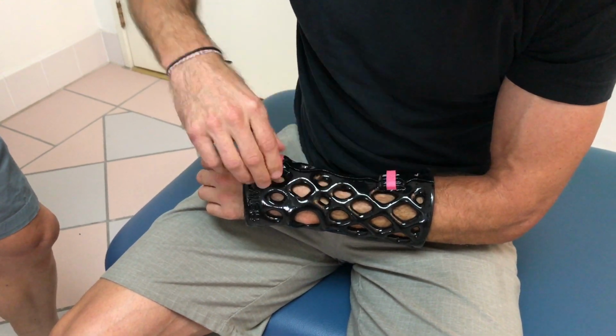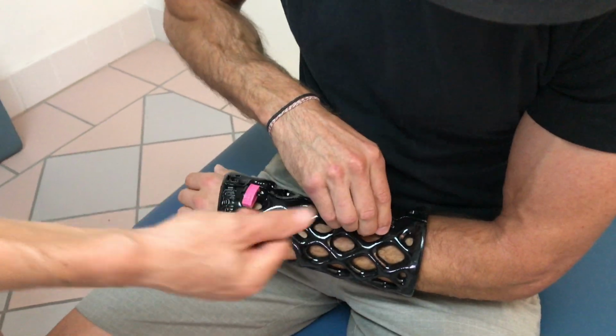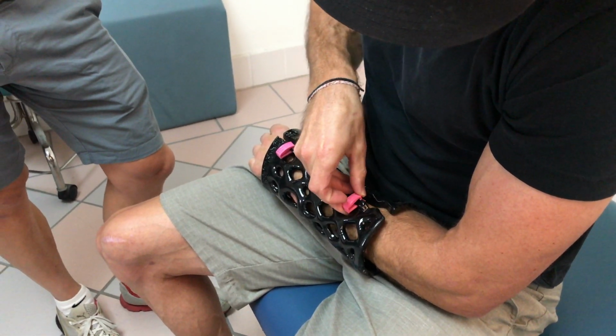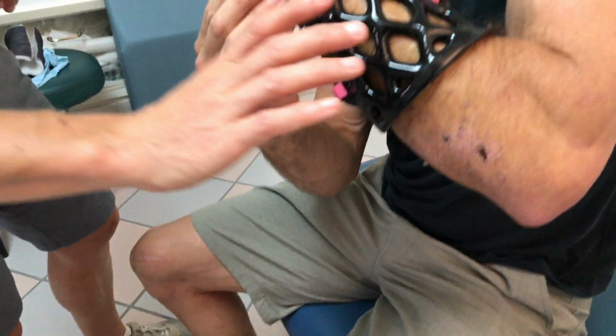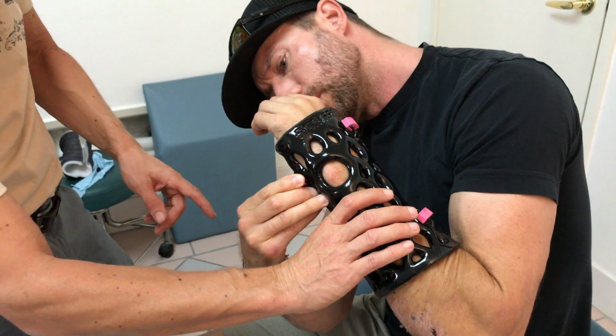Oh, that's pretty. So when you want to take it off, you're gonna pull a little bit towards you, and then up and back, and then make sure it's in that groove. See how it sits in the groove, that way it doesn't fly away. Gotcha. Yeah, that's an interesting development to do that. You'll get used to it. Yeah. So pull it towards you a little bit for the J, and then there you go.